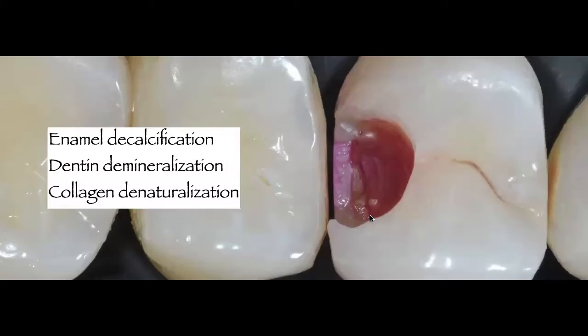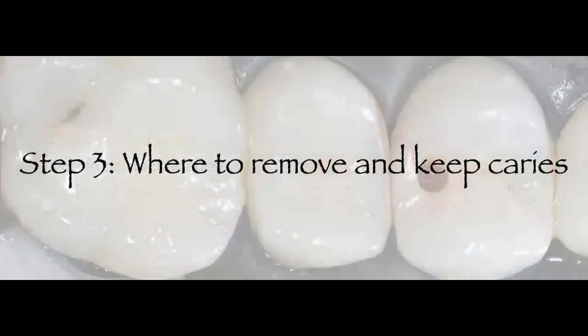So what we're seeing right now, you're seeing the enamel that has been stained. You see a lot of red staining, which means that there's denaturalized collagen in my entire preparation. You can see the DEJ very stained. So that's what I'm going to now start removing.